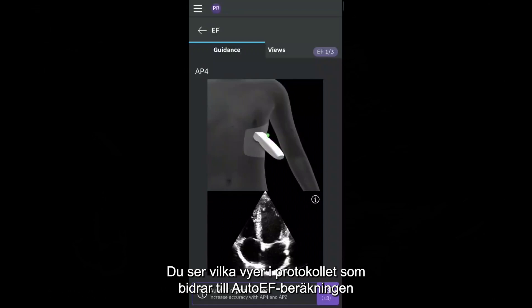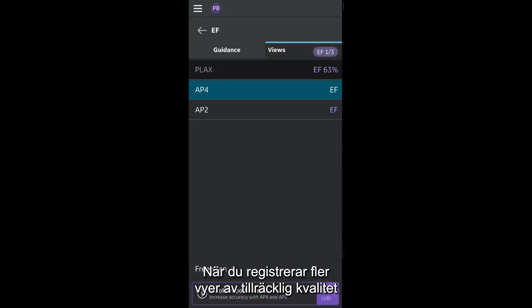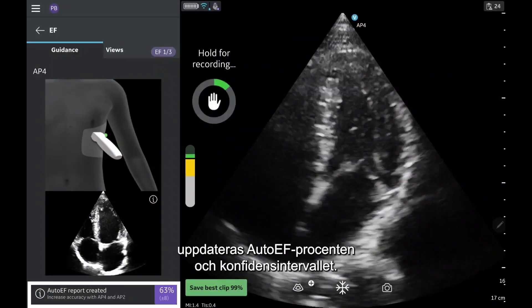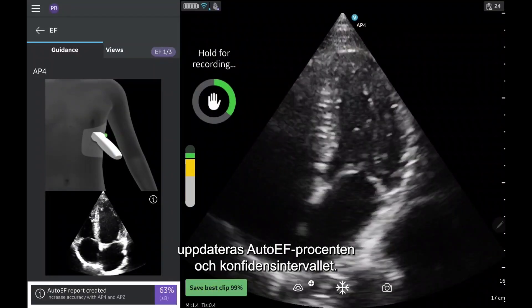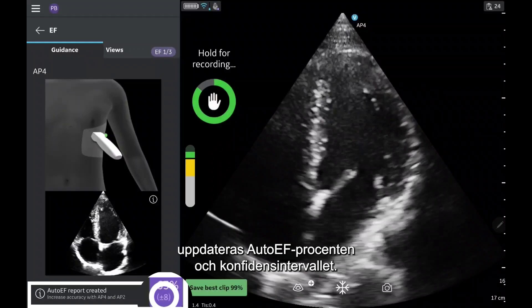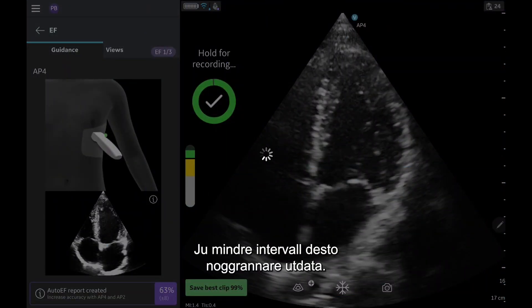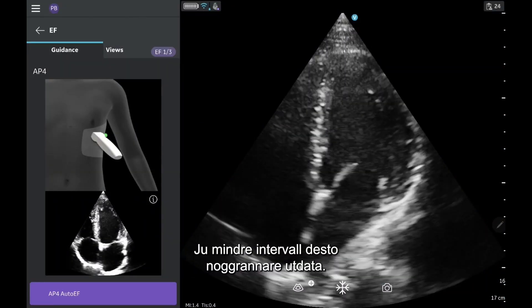To see which views in your protocol can contribute to calculating auto-EF, select the Views tab. As you acquire more views of sufficient quality, the auto-EF percentage will update along with the confidence interval. The smaller the range, the more accurate the output.